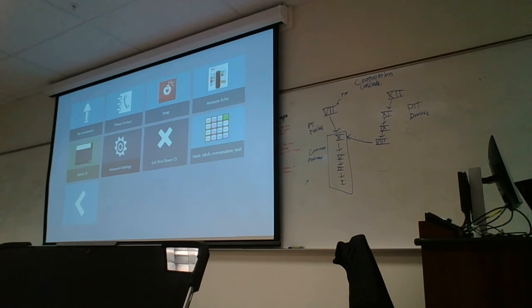And that's because insurance companies see the devices as speech generating first and foremost. At Tobii Dynavox, we understand that people may need access to things like email, to have access outside of the communication software. Once the device is in their possession, the client has the ability to call our company and have the device unlocked. Right now there's a one-time $25 fee, but once they do that, they have full access to the device. And we just have to keep those things separate because of Medicare and Medicaid laws.